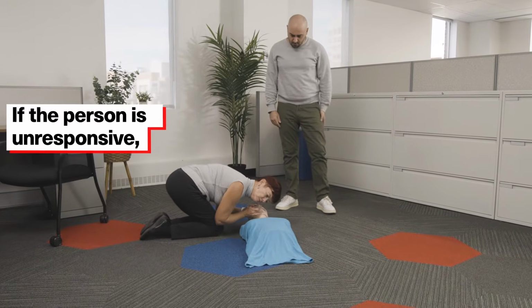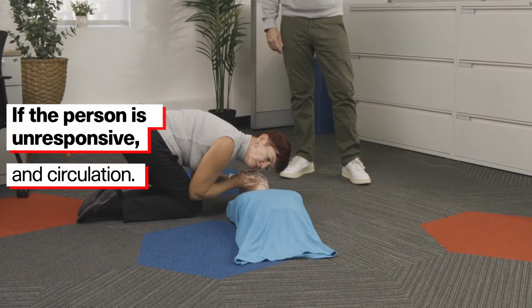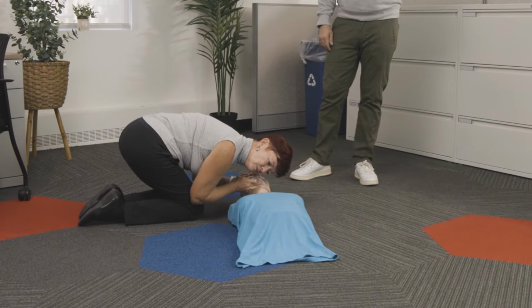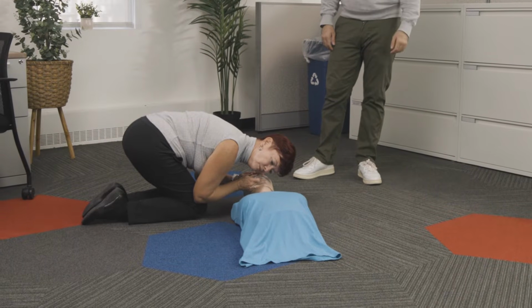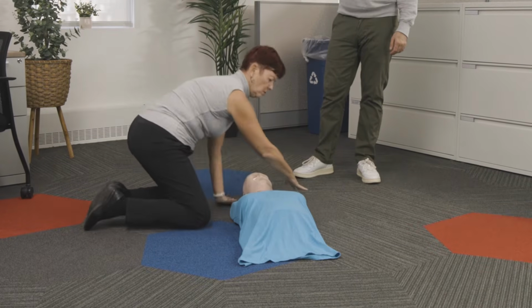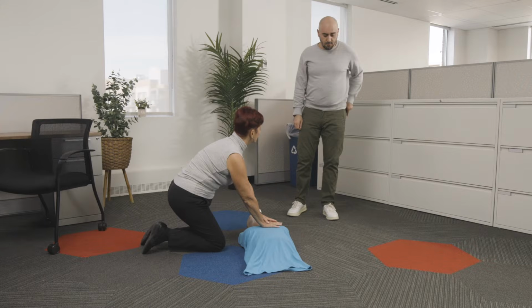If the person is unresponsive, check their airway, breathing, and circulation. Open the person's airway by gently tilting their head back until their chin is pointing up, and check for normal breathing for 5 to 10 seconds. Check their circulation by quickly looking at them from head to toe for signs of life-threatening bleeding. If the person is unresponsive but gasping every so often, they need CPR.